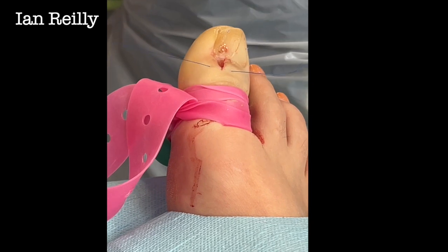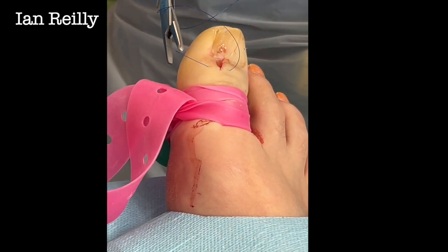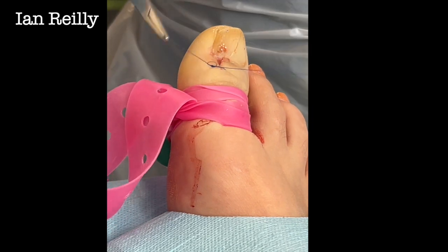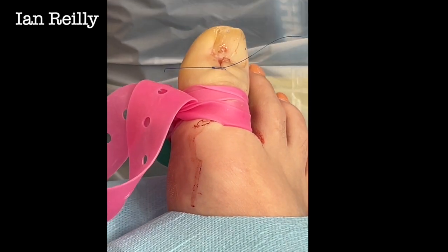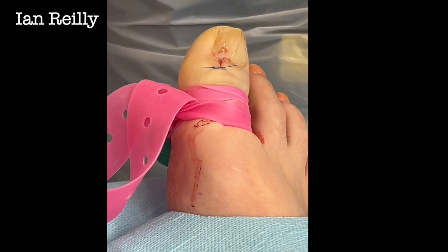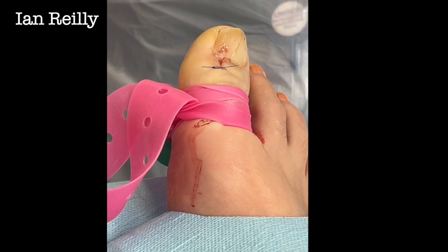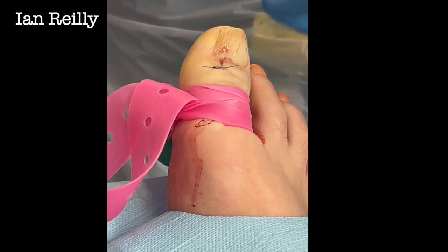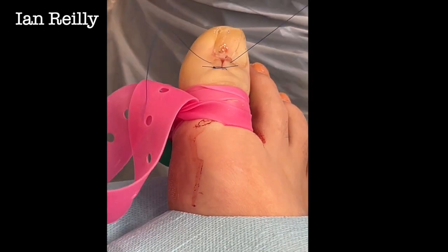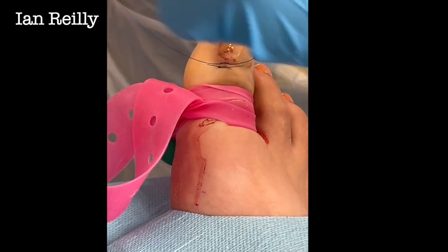There would have been an argument for this one — doing a full Winograd and doing all the nail and the nail root. There would have been an argument for being more aggressive and doing a full Winograd. But with these you never really know what you're going to get until you get in there — it's a bit like that box of chocolates. The main thing is to try and give that nail a chance and to get all of that acquired digital fibrokeratoma out.